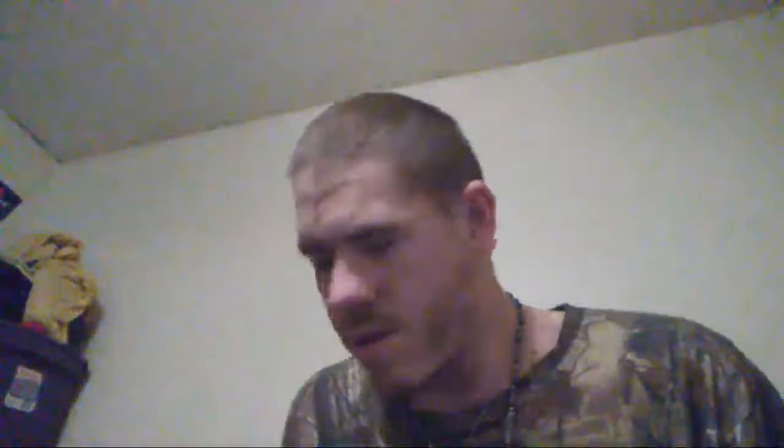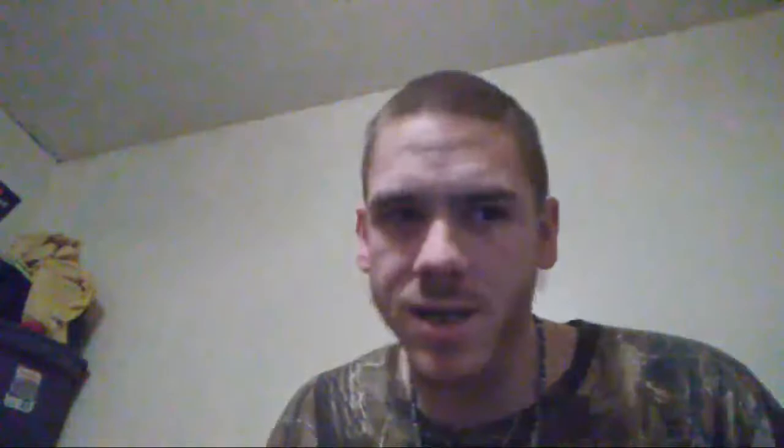With the Freestyle Lite meter, this right here is the case it comes in. This is called a lancet device. I always change the lancets every time — makes it easier, fingers don't hurt as bad. Inside the case there's the meter, which is very small. These are your test strips. The lancet device goes here, and there's a section for the lancets which I'll show you in a second — they poke your finger.